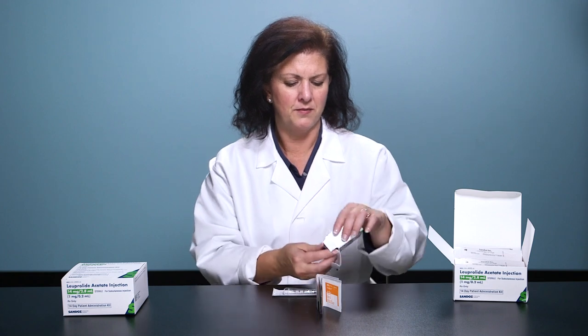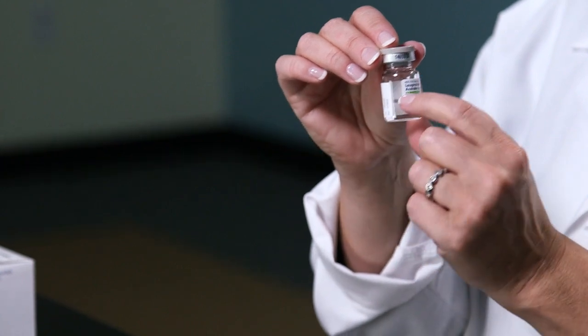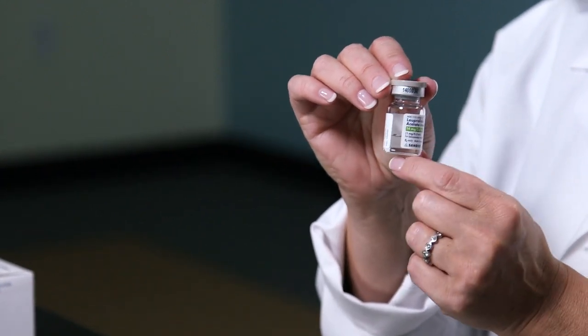Remove the vial from the box. When you receive the full-strength 14-Day Kit vial, it's only filled about halfway. This is normal.